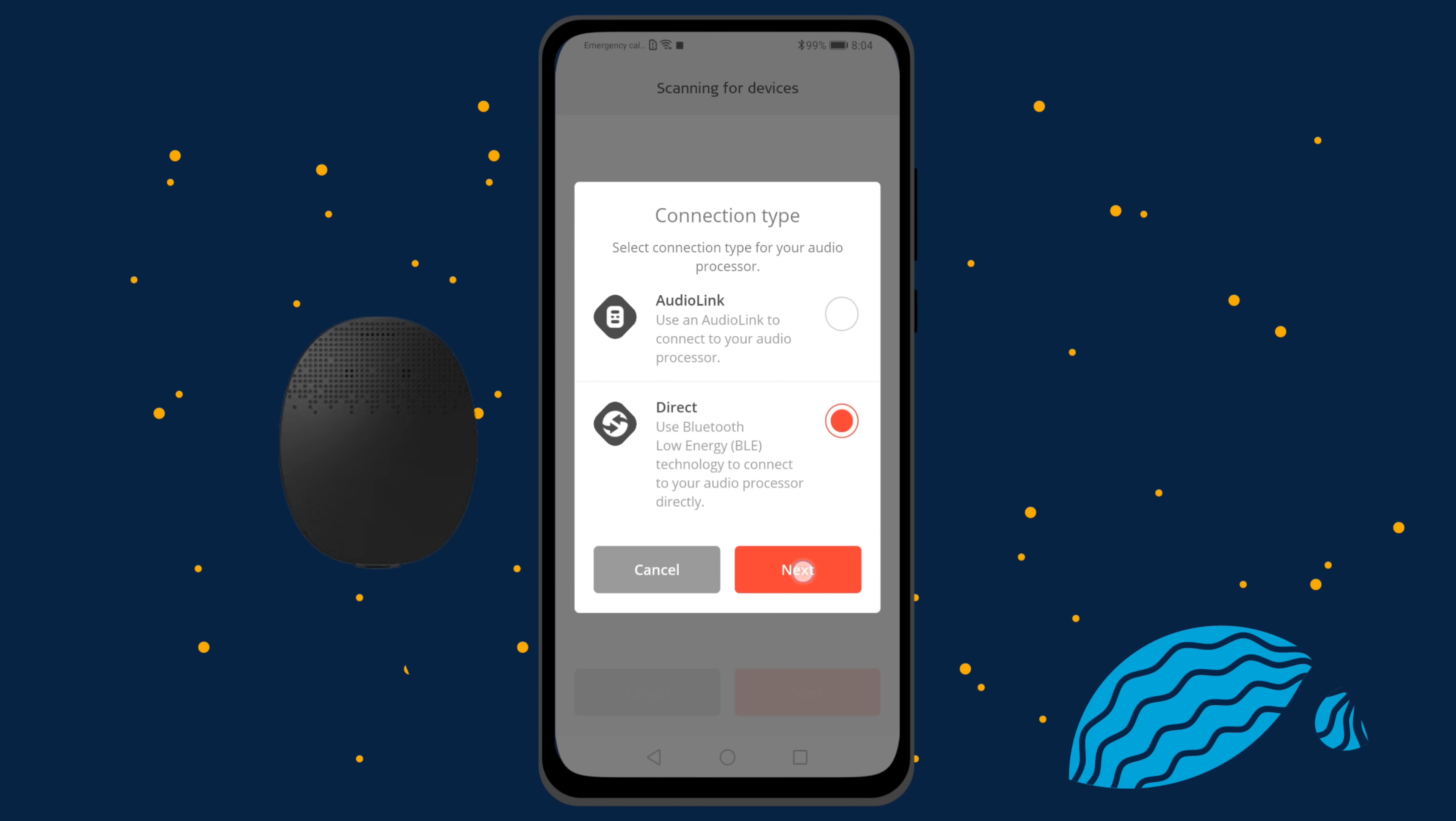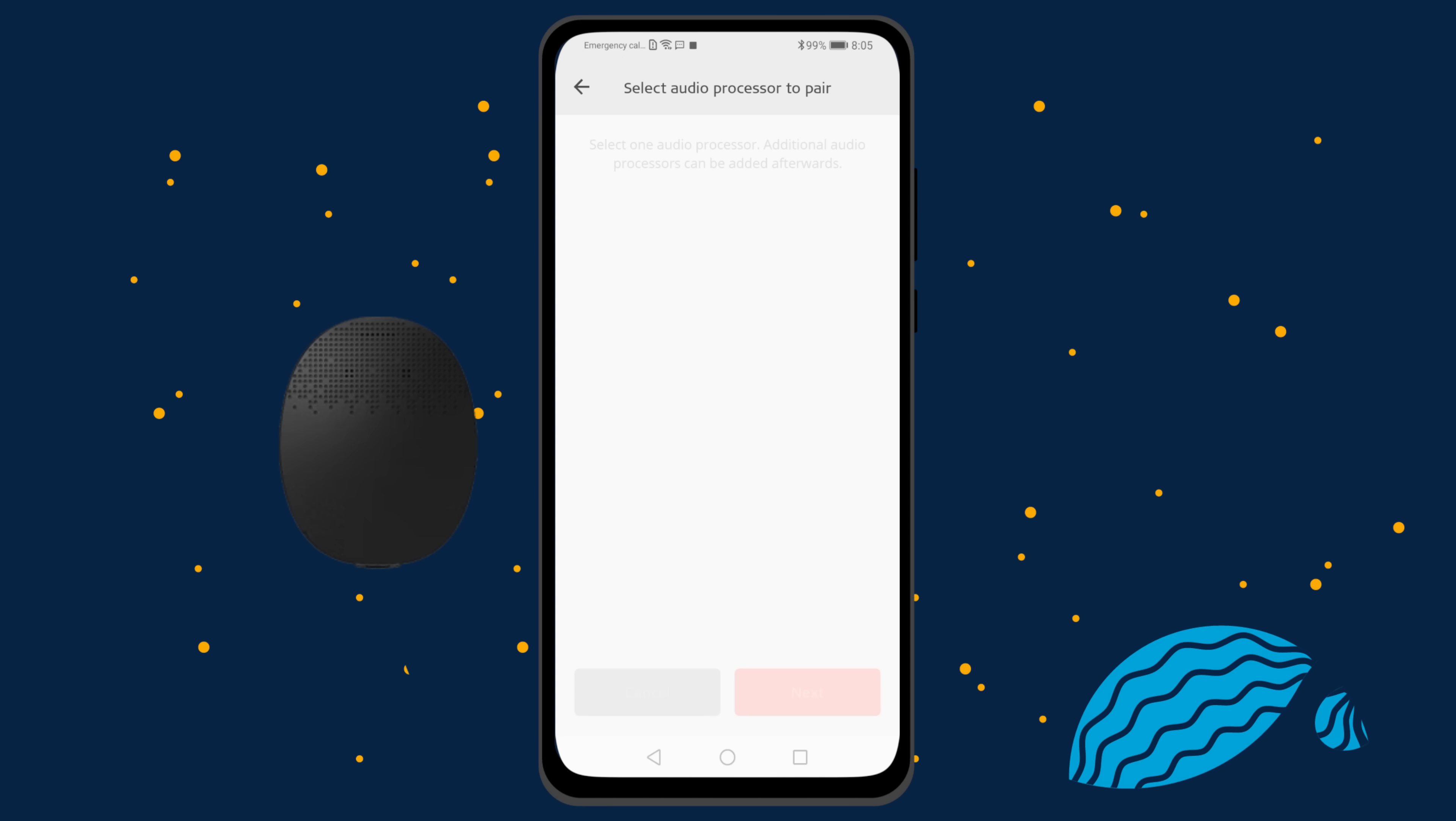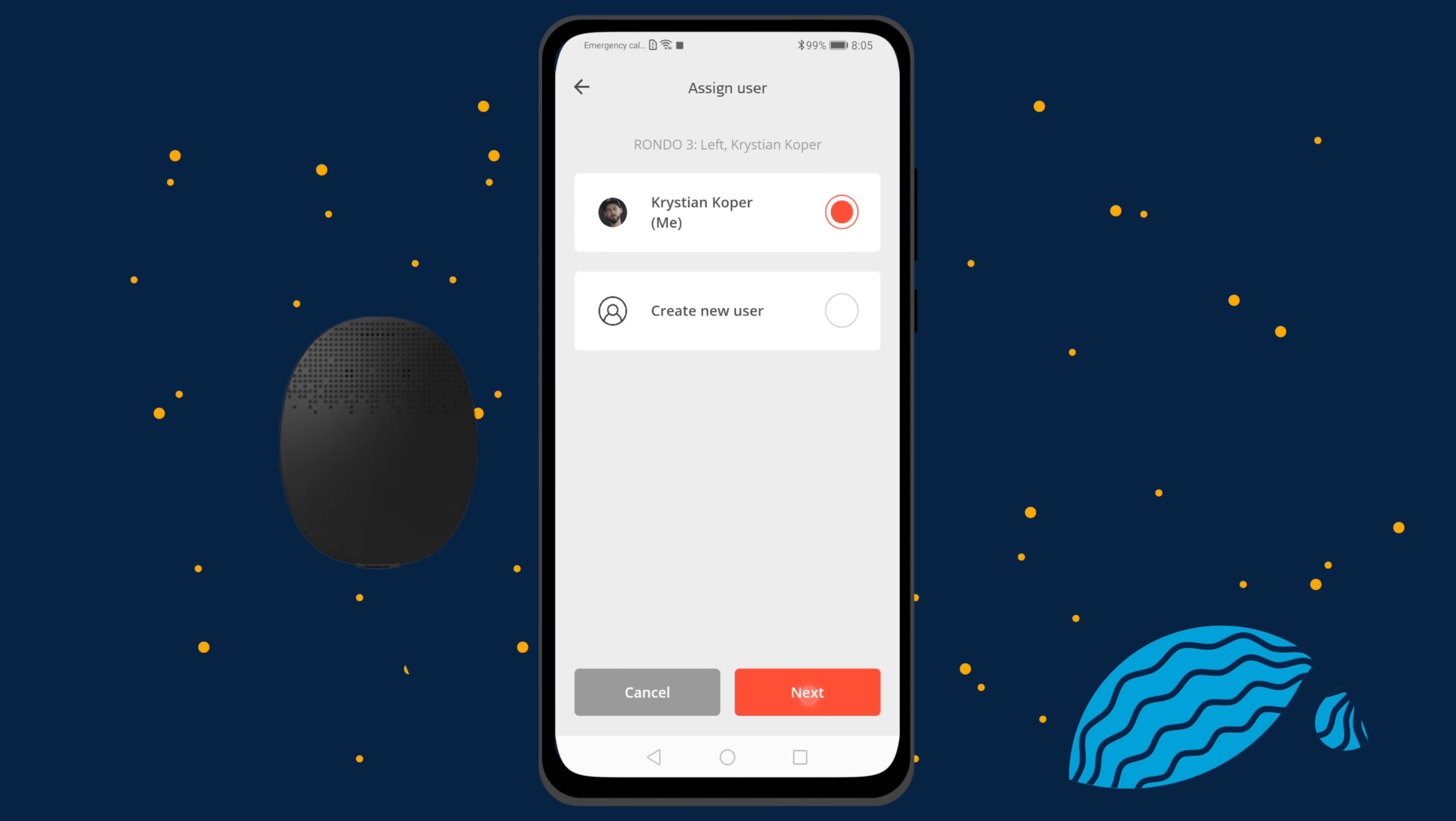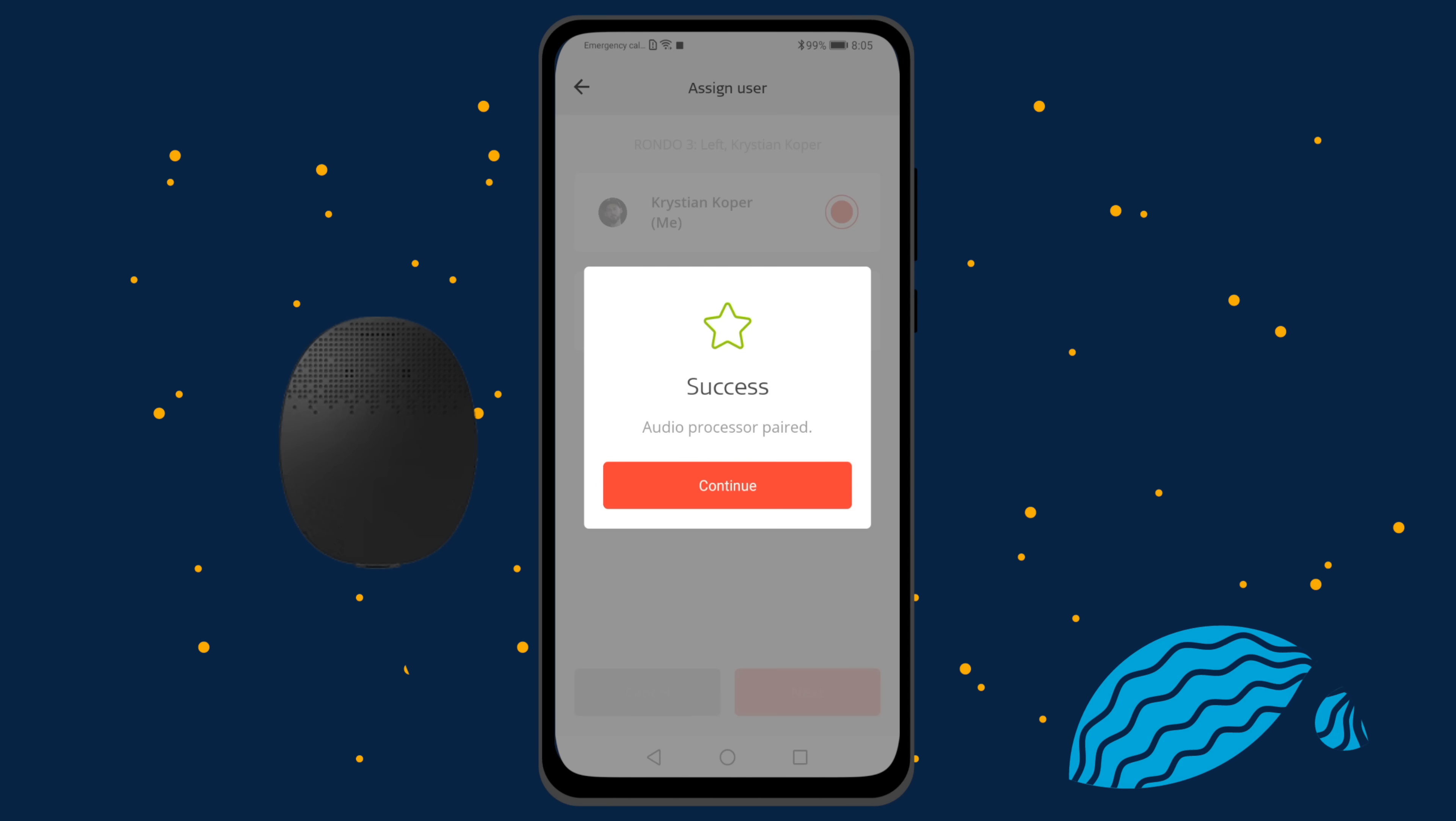Once your Audio Processor is paired, tap Next. Assign a user to the audio processor. If it's your audio processor, select your own account and tap next. If the audio processor belongs to your child, or someone you look after, then select the corresponding user from the list. Tap create new user, then next, enter their name and tap create.